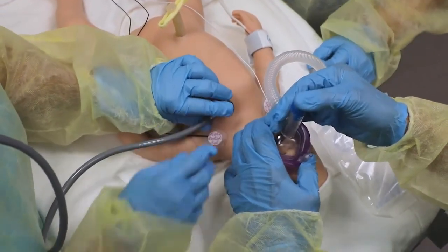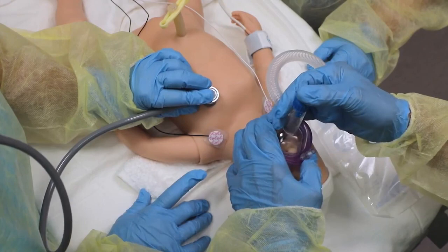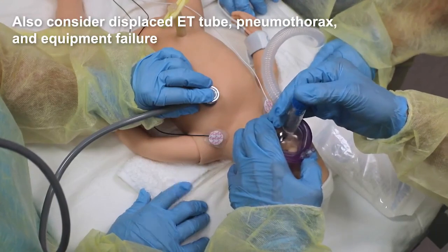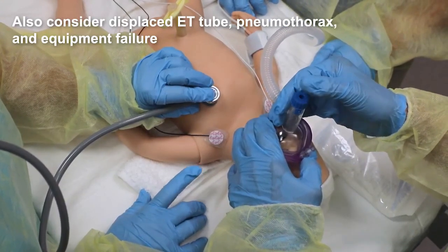If chest movement is evident, ventilate for 30 seconds and reassess the heart rate. If chest movement is not evident despite MR SOPA steps, you must repeat tracheal suction until you have cleared the airway and achieved effective ventilation.